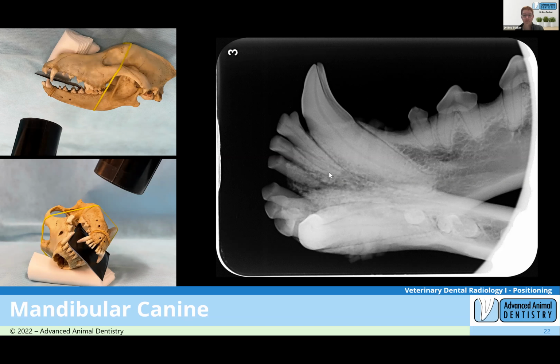I can see on this plate on the screen there's some rolling of the film on the left-hand side, where you can see the white mark up along the left-hand edge. That's because the blue film's coming up a bit. That's from the processor. All the damage to the plate itself has not really been from the animals, it's been from us. I've used the guards a couple of times, but I found that the thickness of that guard did make it a little bit harder for me to get the placement of the film.